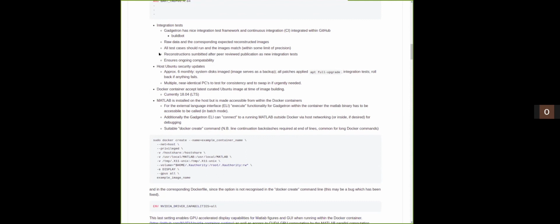And I'm very slow in ever publishing anything, so I will submit my reconstruction after the peer-reviewed publication. But I've put some snippets on for the technical side today.